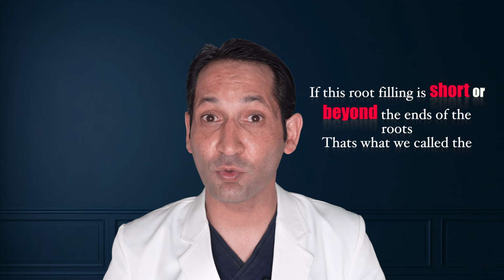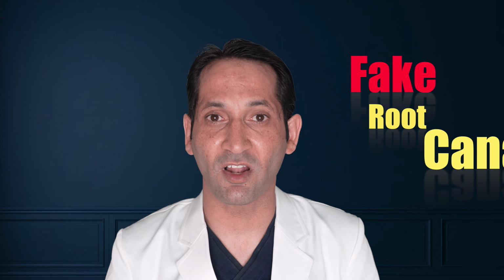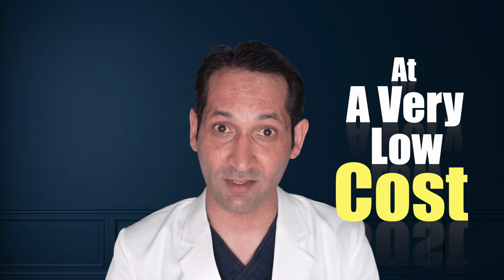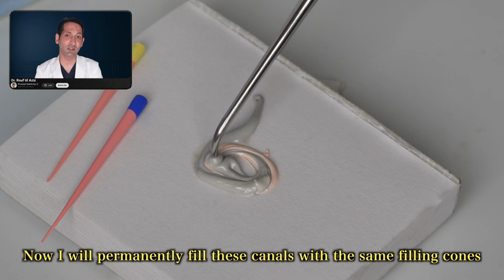Perfect. If this root filling is short or beyond the ends of the roots, that's what we call fake root canal treatment. And it actually happens in most of the countries where they offer root canals at a very low cost. Okay? Now I will permanently fill these canals with the same filling cones.